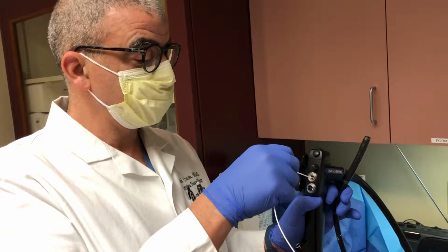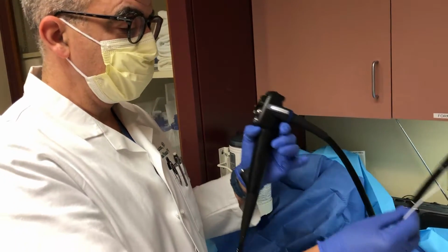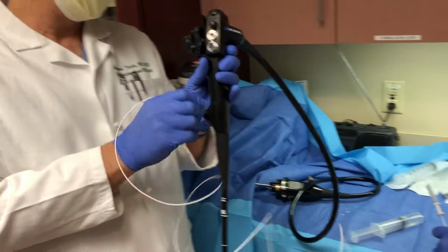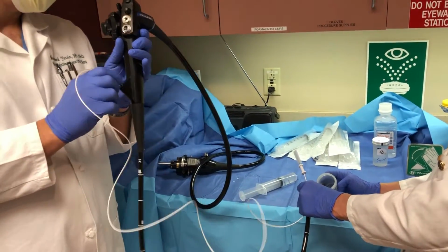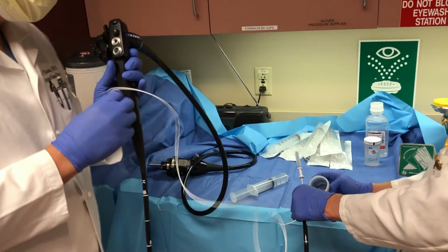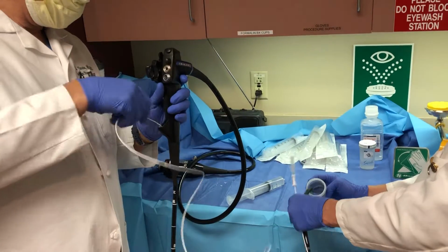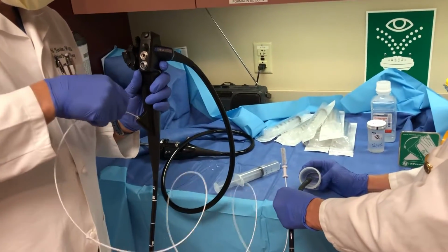We usually just brush it a couple of times. And this is the antegrade, and I'm brushing through the lumen. I'm going to hold the lumen over and capture any saline that's pushed out through the brushing, because that's where likely there are particles or bacteria that we could capture. And you push that brush through until the brush comes out the other end.